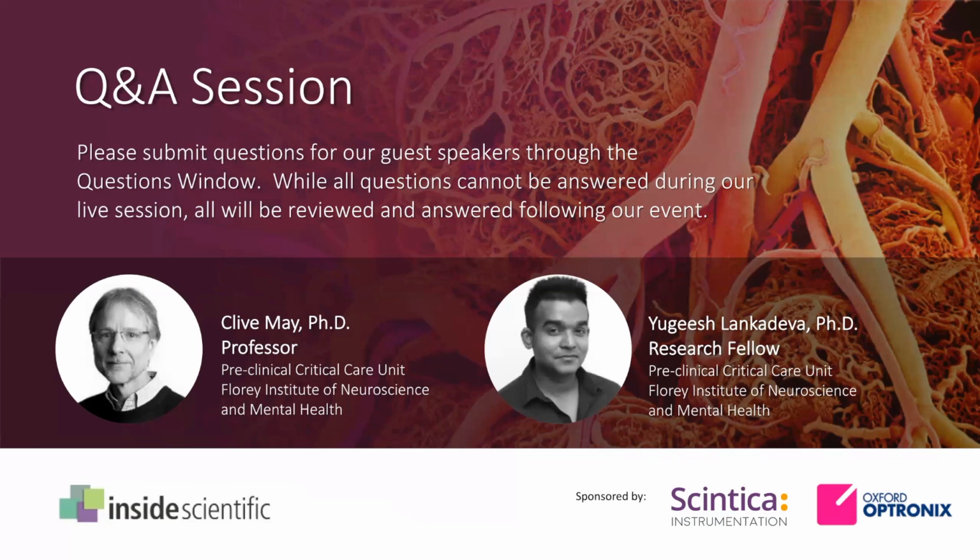Excellent. And I'll just add towards the end that once we do take these probes out, it is possible to do a quick check if the calibrations are still in. What we commonly do is we test it in room air, and then we bubble it in a solution with carbon dioxide to see the upper and the lower limits, and that gives us confidence that these probes are still detecting changing oxygen levels, so we can reuse them if we had to. Perfect. That makes a lot of sense.